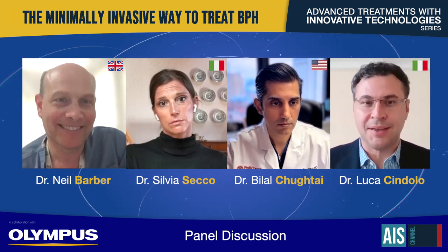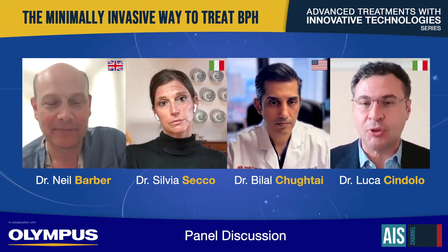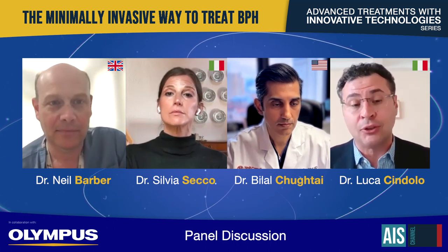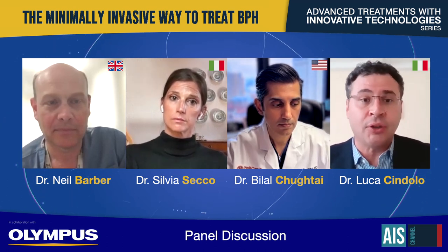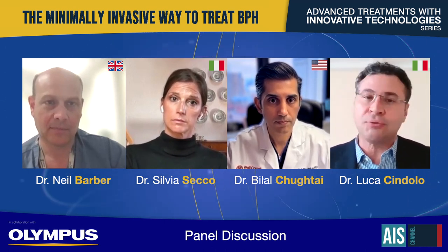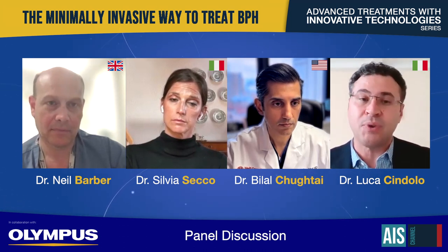Thank you, Neil, for this question that is a matter of everyday practice. So when a patient comes to me asking for a treatment for palliation of symptoms, I analyze, as I said before, the parameters we know: the shape of the prostate, the volume of the prostate, the expectation of the patient, and also the capability to tolerate the first part of the post-operative course. A patient that cannot tolerate, even psychologically, a catheter is of course not a candidate for Rezum or other catheter-requiring techniques. A patient that is not familiar with a definitive implant, we can offer, of course, iTind instead of UroLift. So for me, it's a matter of patient preferences.